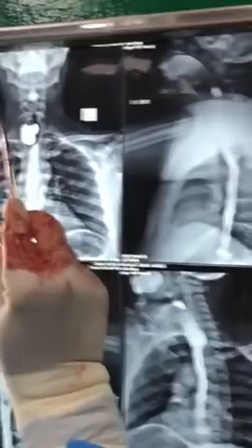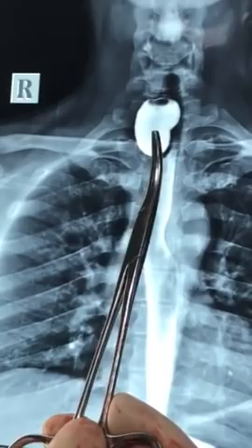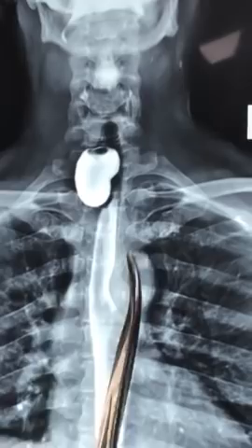This is a case of dysphagia and gargling in the oropharyngeal region. A diagnosis of Zenker's diverticulum has been established. This is the diverticulum and this is the esophagus, proved by contrast study.